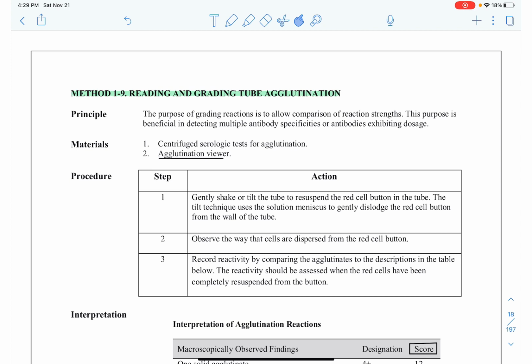As an example, in the reference lab I currently work in, a patient was referred with an antibody which reacted with all cells tested. The autocontrol and the DAT were negative, indicating the presence of a possible antibody directed against a high incidence antigen, meaning an antigen which most of the population possesses. The serologist performing the workup phenotyped the patient, which revealed a phenotype of M negative, N weak plus.